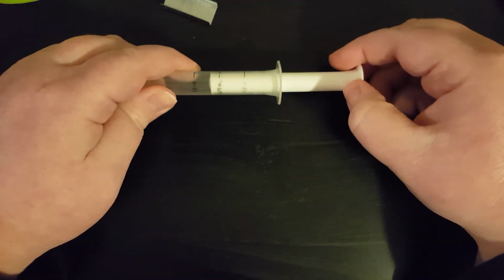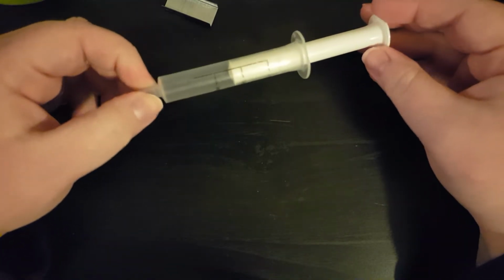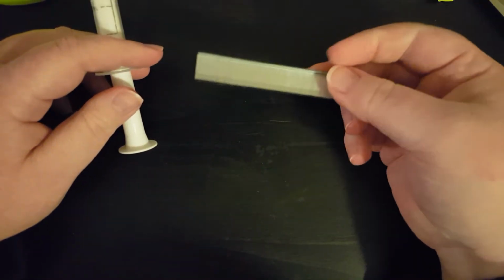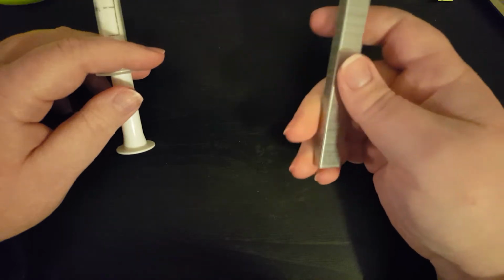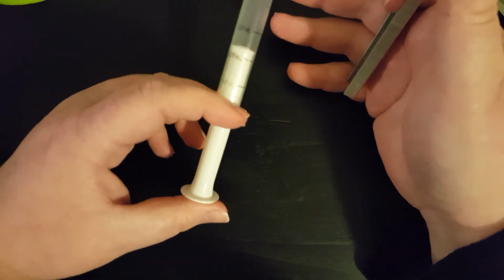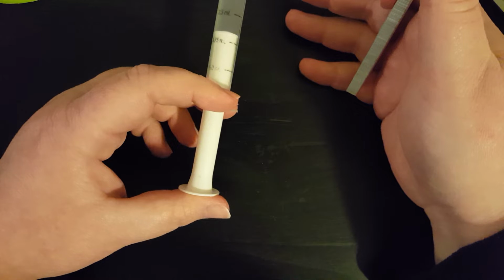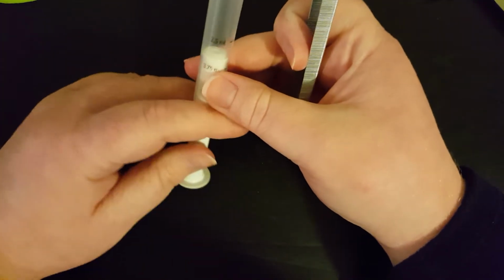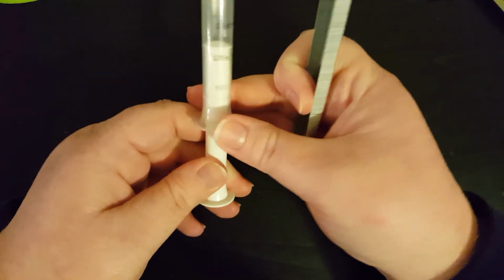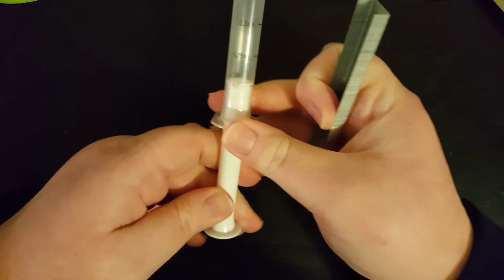There are technically other ways to do it, but the method I'm going to show you can be used with anyone, whatever usable or non-usable vision they have. What you would do is you have staples, you just pull them out of the box. You have a whole row of staples. You may need sighted assistance, whether it be a friend, a rehab therapist, or even something like Be My Eyes, okay? You would want to have a measurement of each on your scale of measurements, but right now we're going to the 5 milliliter.